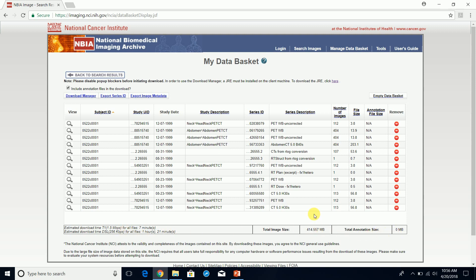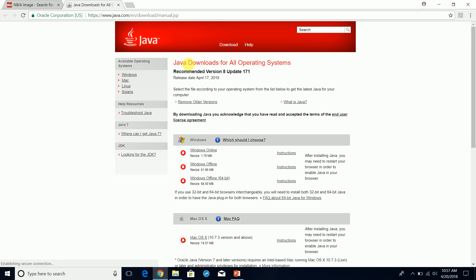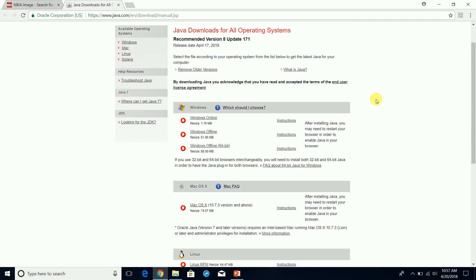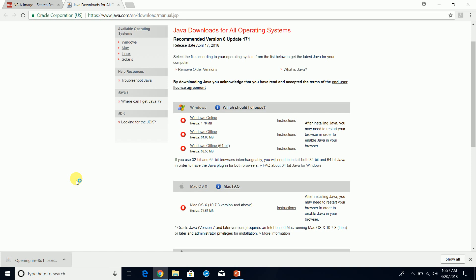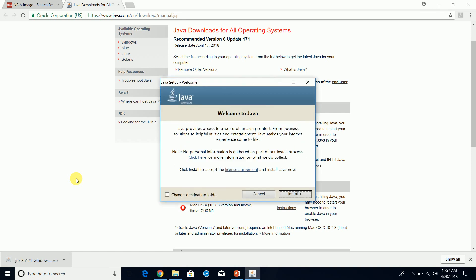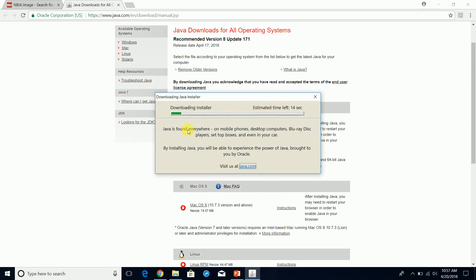Before we download, we're going to have to install Java Runtime. If you don't have Java Runtime, you can install it. For Windows, you can choose Windows Online or Windows Offline. If you have a Mac, you can use the Mac OS X option. Let's click on Windows Online and install Java Runtime.